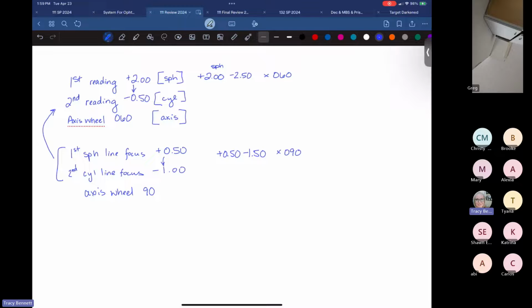And lens clocks, where do we put the center pin of the lens clock on the lens? Again, at the OC, right? Yeah, at the OC.